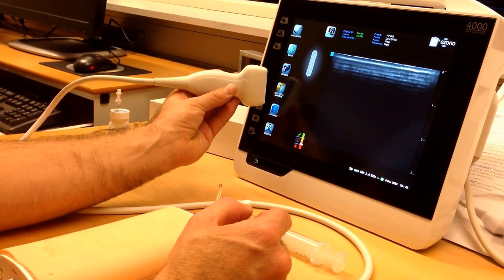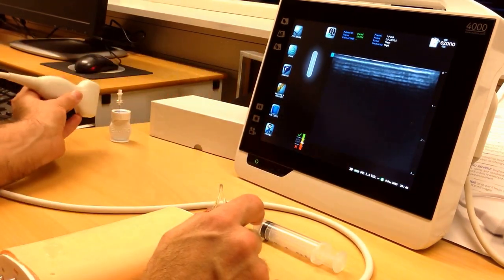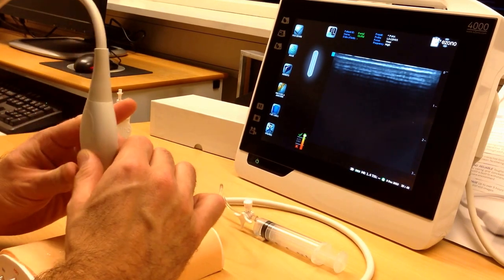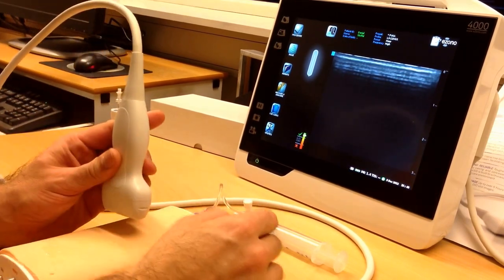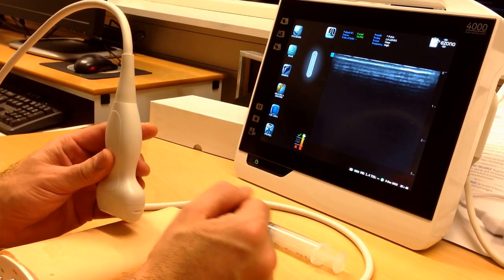If you come with the probe close to the screen, you will see that you're going into the red field, or close to the magnetizer — you will see that this is where you're not going to go. So if you have a clock or something with a magnetic field, it will probably interrupt your field.